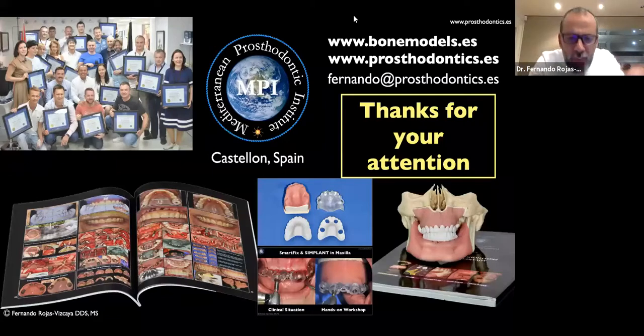So when you are working and doing the wax up, you finish with the teeth. And I don't measure exactly how many millimeters, more or less. When you make the movement, you create the position. And when you finish, you have this distance, but I don't check exactly this overjet or this overbite.